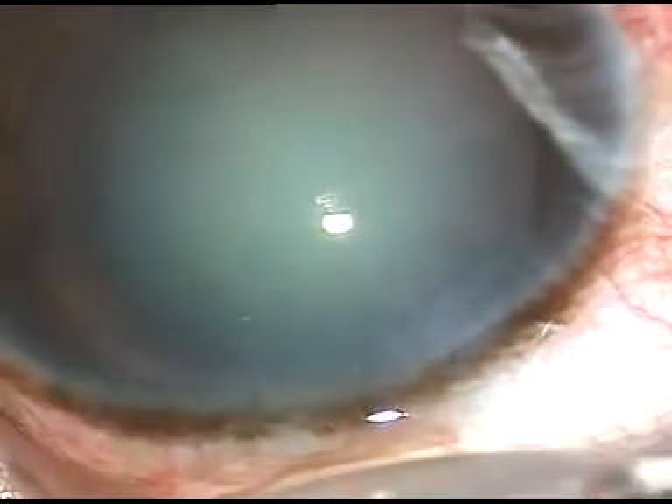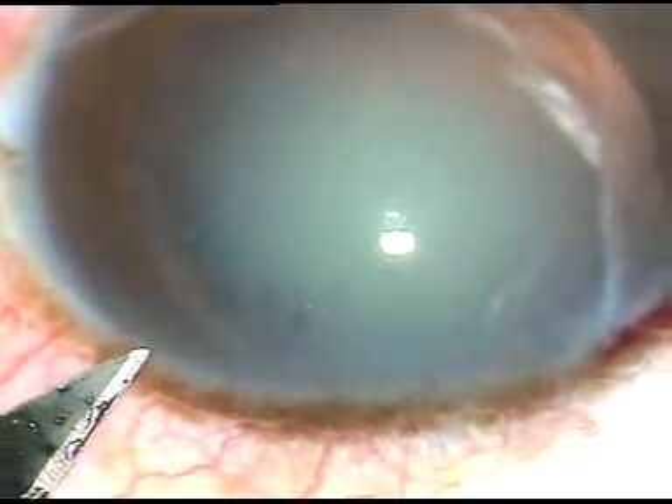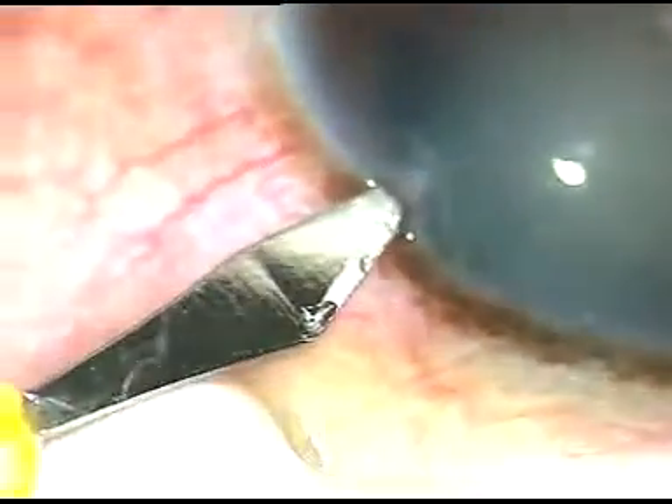This is the main incision — a 2.8 mm keratome has been used to make this incision. Now this is the side port incision on the left side of the main incision.